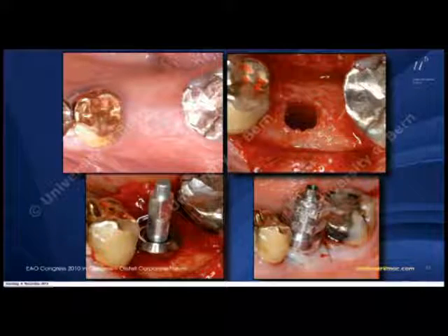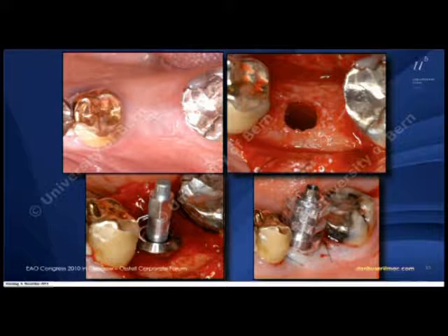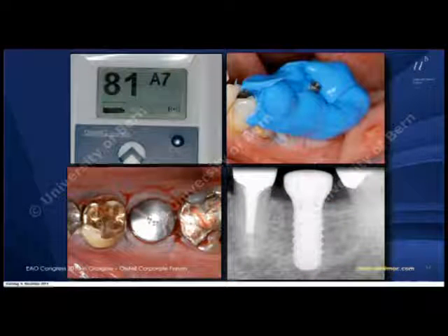So 2005, we started that three-week loading study in healed sites in the posterior mandible, mainly first molar replacements, and as I said, non-grafted sites. That means implants could be placed without bone grafting, so implants were inserted, then the measurements were taken, and to allow a full functional load at 21 days, we took intrasurgical impressions to prepare then the provisionals, and then at 21 days we measured, and if a certain ISQ value was present, we initiated full functional load.